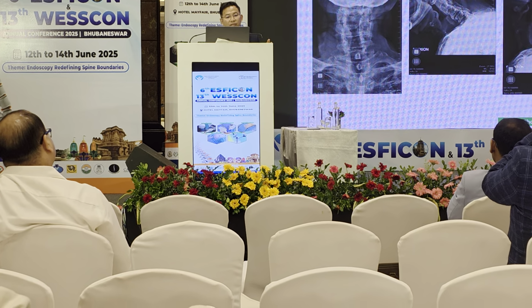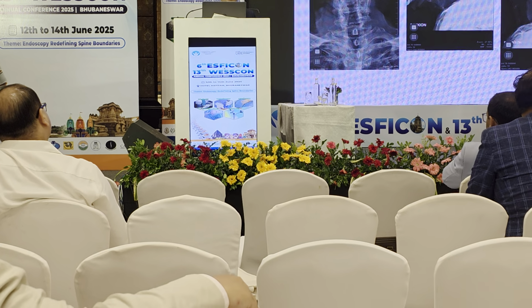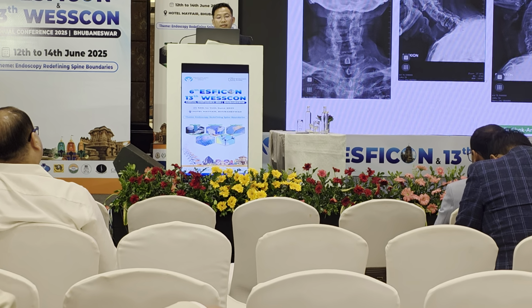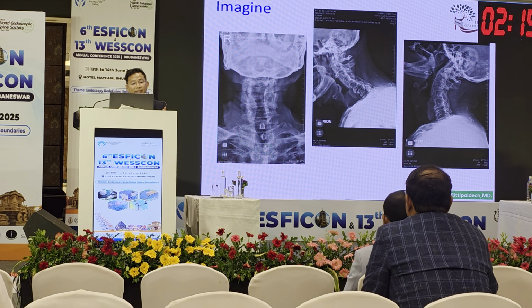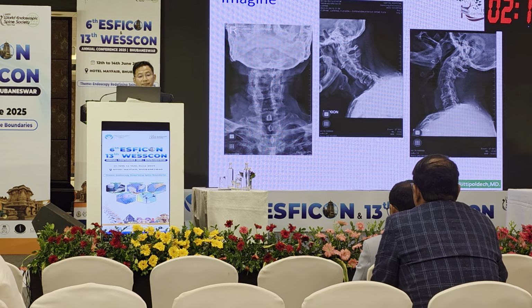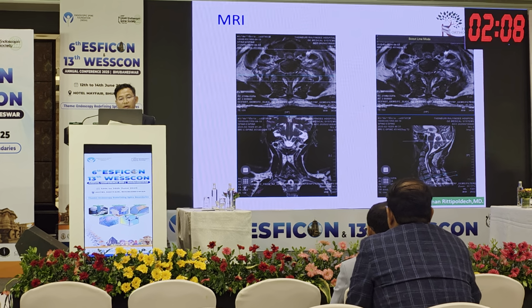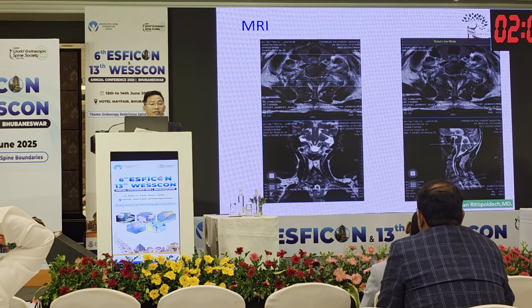The patient had surgery without decompression around 10 years ago. You have to check the stability first for this, because this case is not a first case. This is the MRI. You can see the spinal cord was compressed at the cervicothoracic junction.